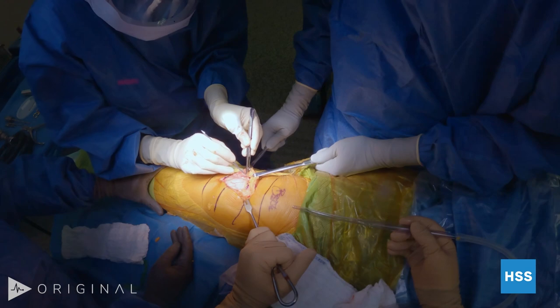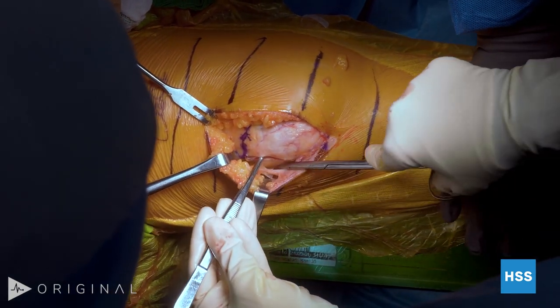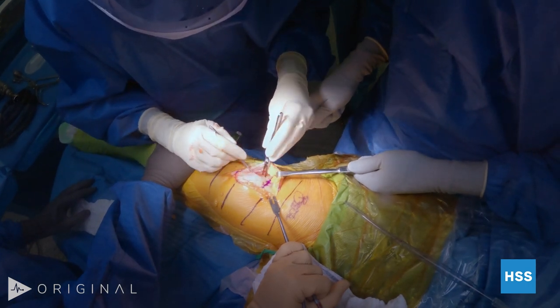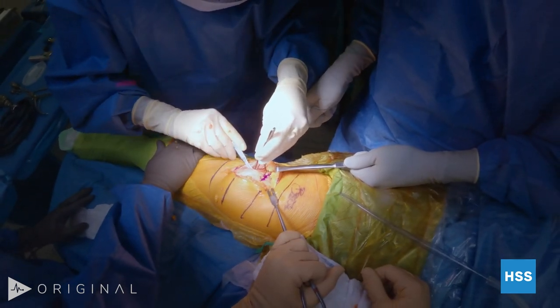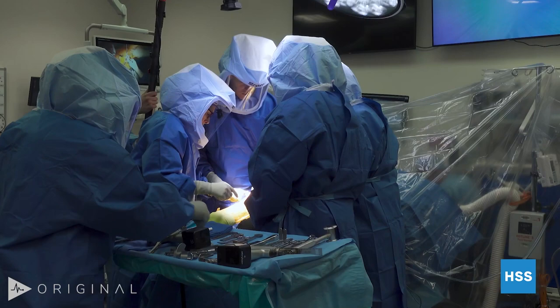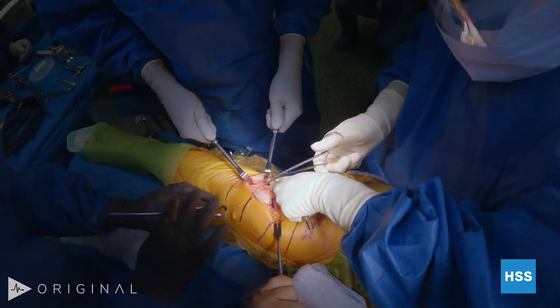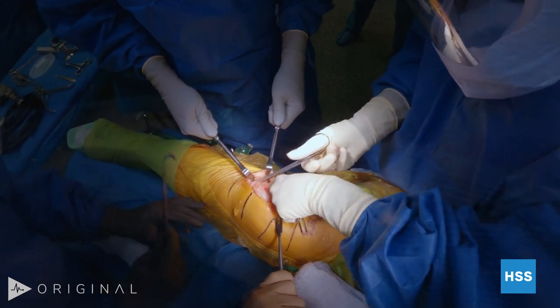So this is capsule, and this thick tissue over here is retinaculum. We've split them because we're going to use that extra tissue to close over the lateral lengthening. It looks like a flimsy piece of tissue, but it closes well. We're going to make our lateral peripatellar arthrotomy — that's what we'll close at the end of the case. When coming down, whether medial or lateral, you want to be able to feel the meniscus and take it in steps so you don't violate it. We're not doing a total, so you want to make sure you can protect it.